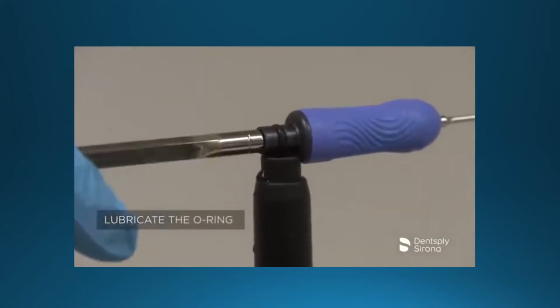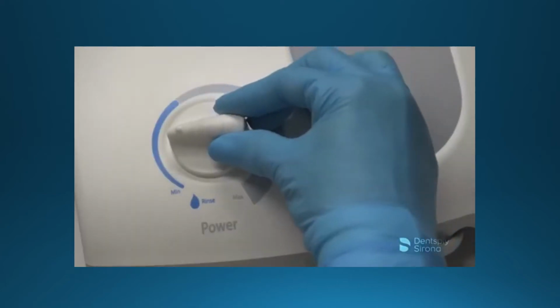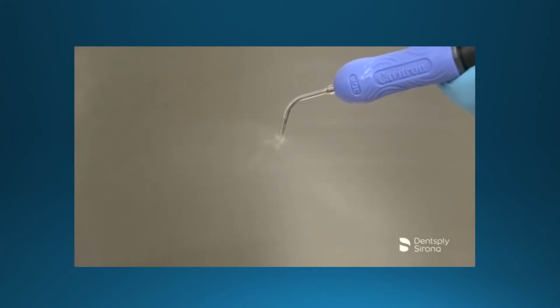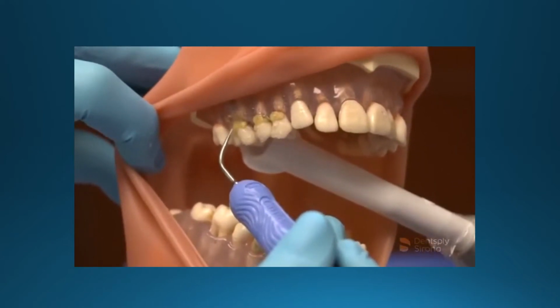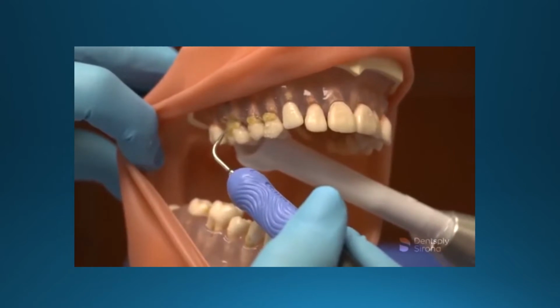After the clinician has filled the handpiece with water, seated the insert, selected the power, and adjusted the spray properly, instrumentation begins according to the treatment plan prescribed for the patient. The clinician begins by adapting the lateral surface of the Cavitron FSI 10 on the clinical crown and activates the foot pedal to begin the stroke.